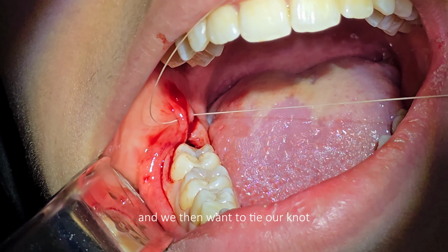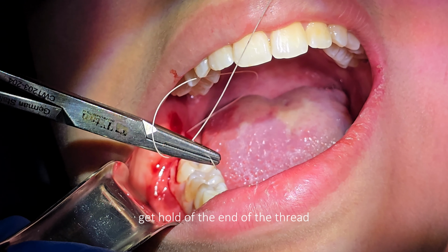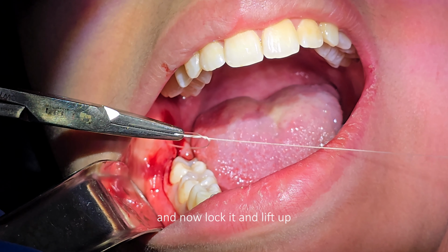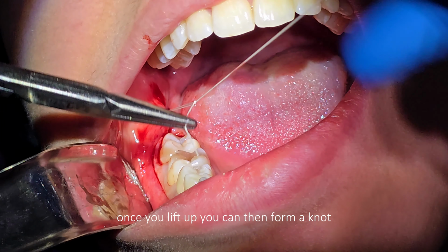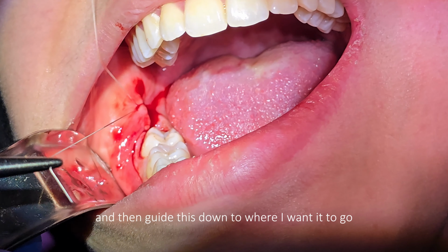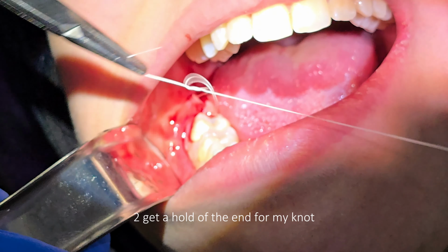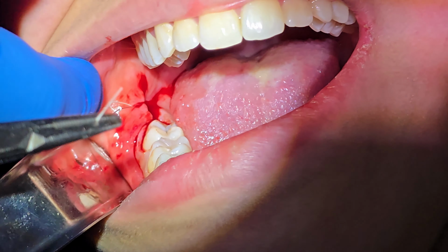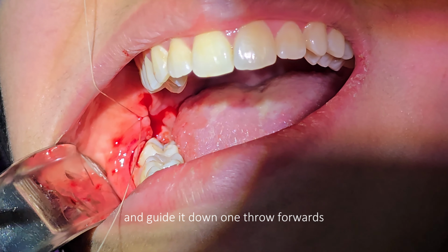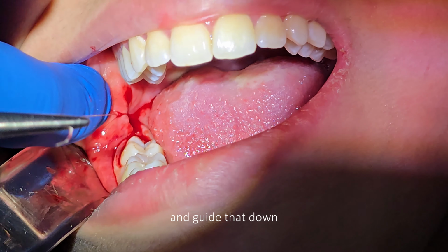And we then want to tie our knot. My method to tie a knot is to do one throw over the top, get hold of the end of the thread, and I'll lock it and lift up. Once you lift up, it can then form a knot and then guide this down to where I want it to go. And then 2 throws back, 1, 2, get hold of the end, form my knot, and guide it down. 1 throw forwards, and guide that down.